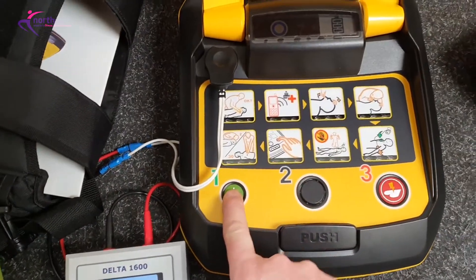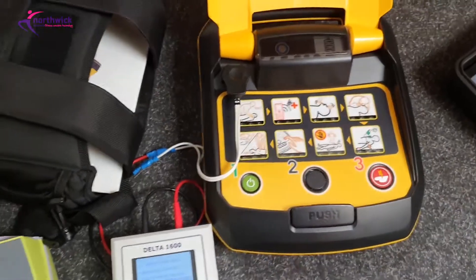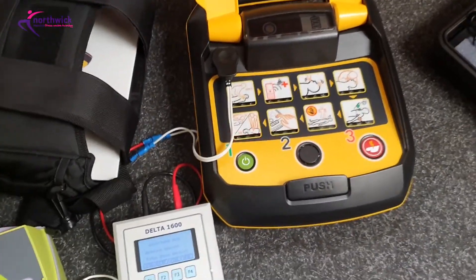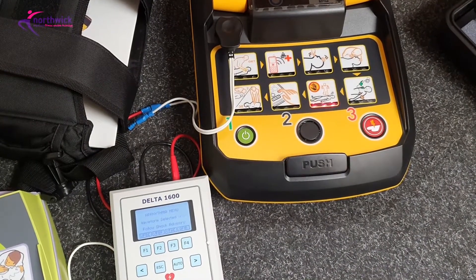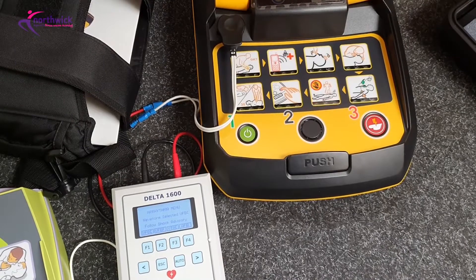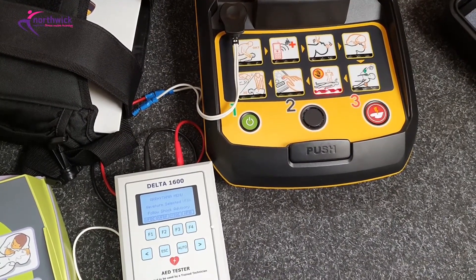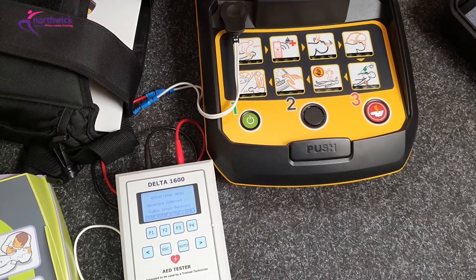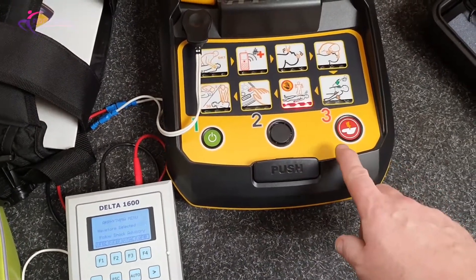I'm going to turn the defibrillator on and you'll see it run through its normal startup process. It will then analyze the heart rhythm and check whether a shock is required. It should say that a shock is advised.